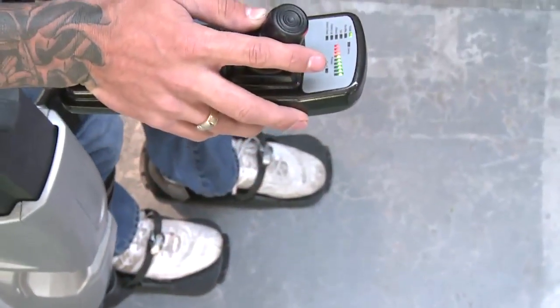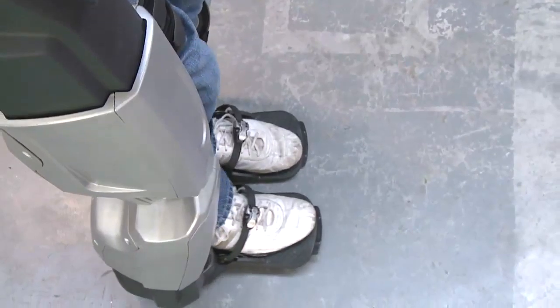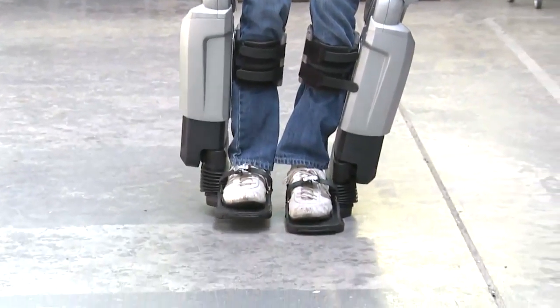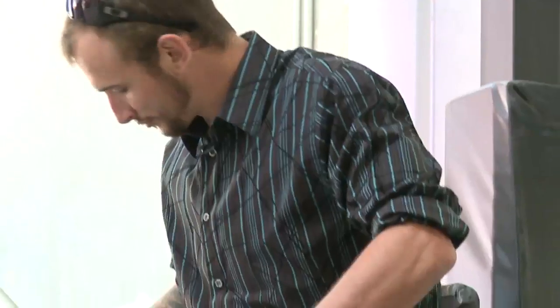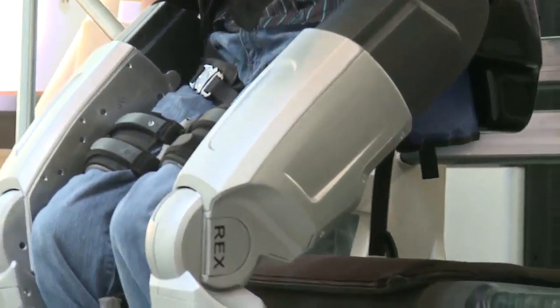It was quite funny because everyone's trying to tell me to look in the mirror and watch the movement and get familiar with it, and I just couldn't look up. I spent the whole time looking at my legs moving. It blew me away. I told the doctors when I had my accident, I'm going to walk again. I didn't realise I was going to walk in a robot, but this is just blowing me away being able to watch them one foot in front of the other again. Couldn't ask for a better feeling.